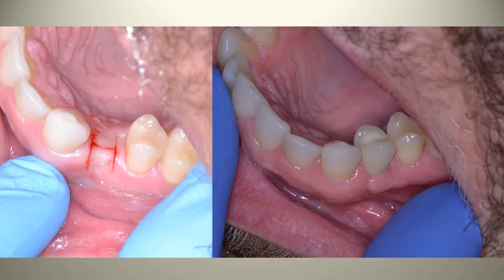So to show you a photograph of the patient with that H incision on the left and what the case looked like a few months down the road, as I'd mentioned to you, when you do cement that tooth, whether it be a screw retained or cemented crown, it pushes up against those weak H incision lines and puffs out the tissue, and you end up getting a very, very nice emergence profile for the patient. So here's a picture of that right there.